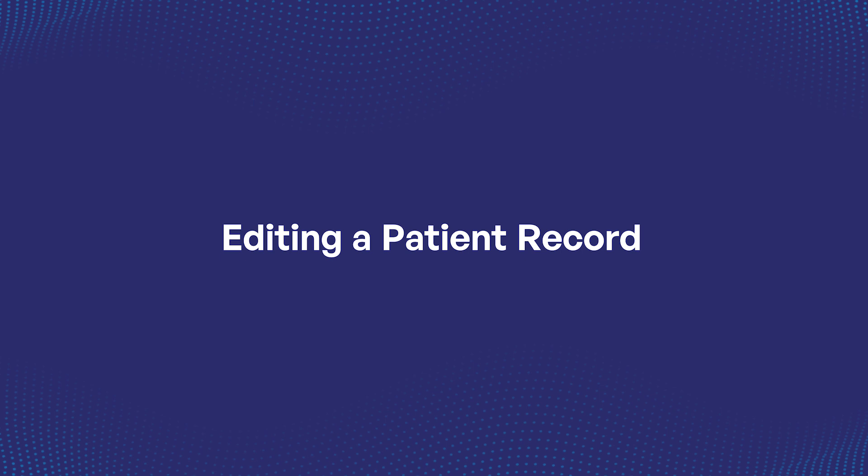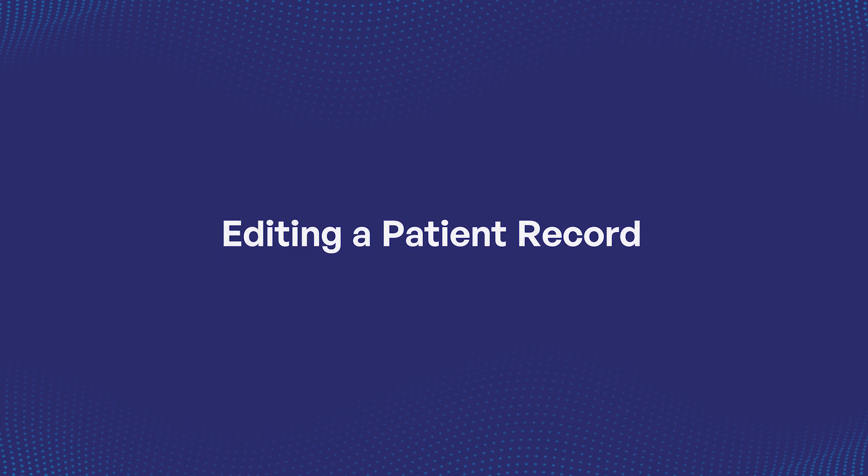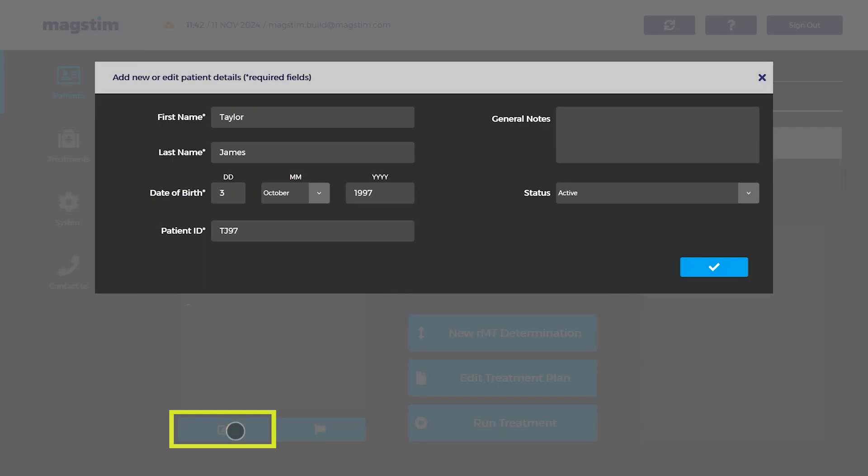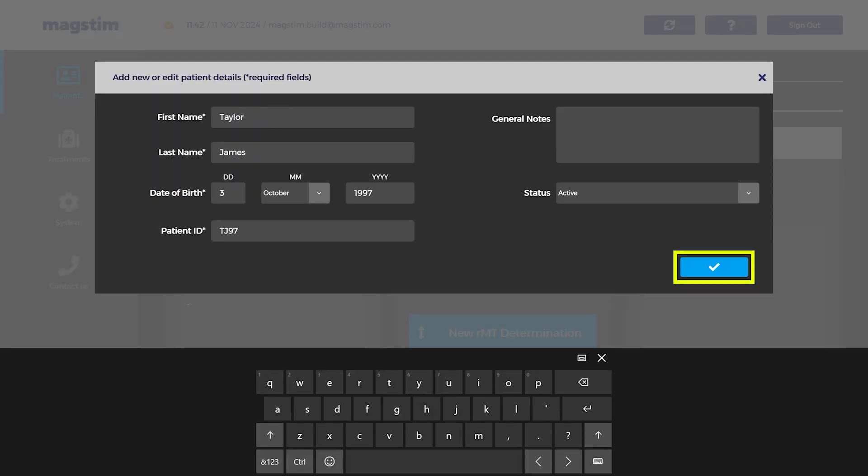Editing a patient record: To edit the patient details, open the patient record and select the edit icon from the overview page. Press the check icon to save.